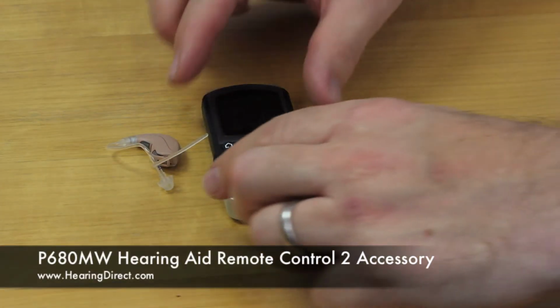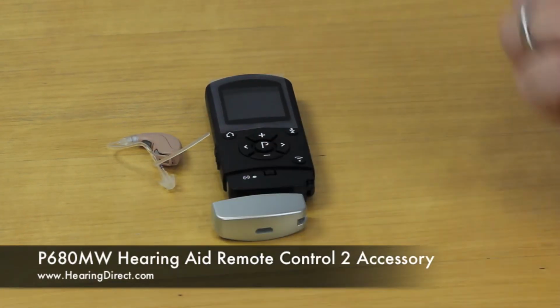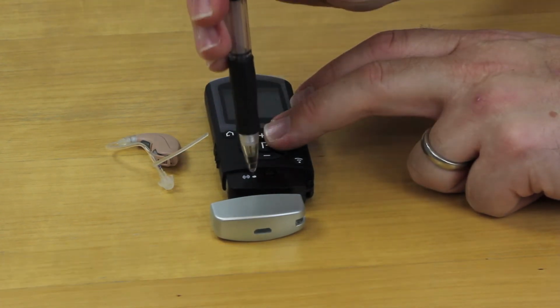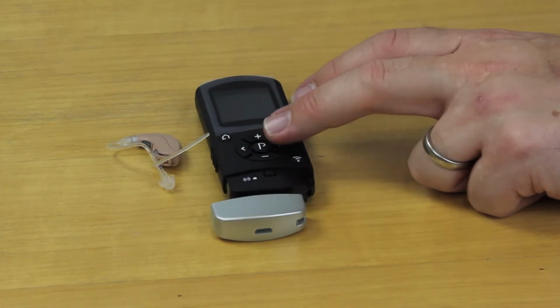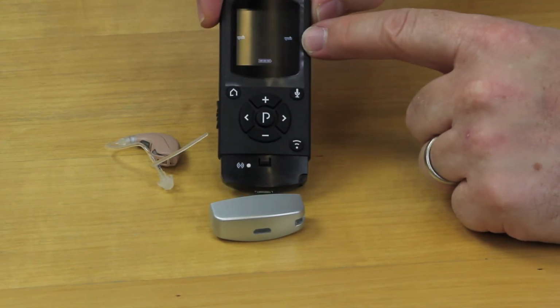Remove the silver case from the base of the remote and press the small white pairing button. The remote control will remain in pairing mode for 20 seconds.